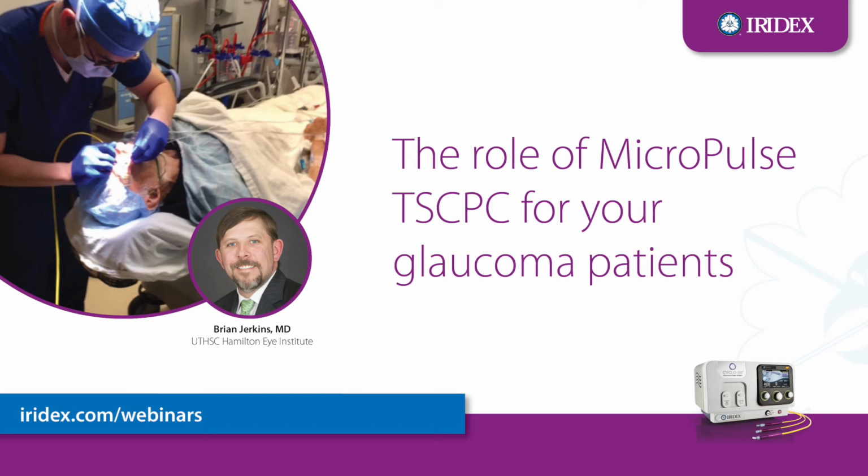And on the other side of that, treatment time is probably the one variable that I'm playing with the most, because there are so many subtle things that are playing into the part. I'm working more on technique and adjusting my time. So for instance, if I'm concerned about a patient who might not have a lot of other options, but we don't want to over-treat this patient potentially, I may only use seconds or I may only treat just the superior hemisphere. I'm trying to treat somebody and get a drop in pressure, but also this isn't somebody who needs an enormous drop in pressure, and I don't want to potentially cause a hypotony.